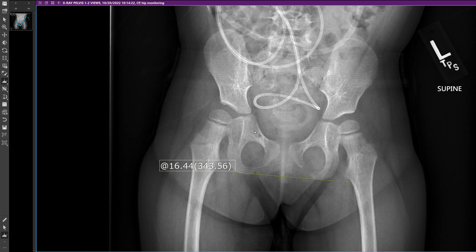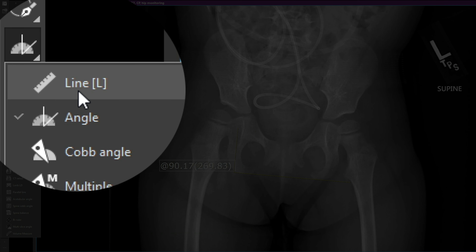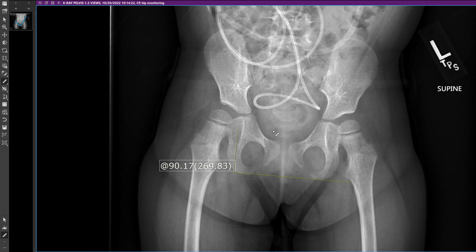I go ahead and make an angle that's about 90 degrees, as close as I can — close enough. Then I make six parallel lines. I go back to the line tool and draw six lines parallel to that angle.